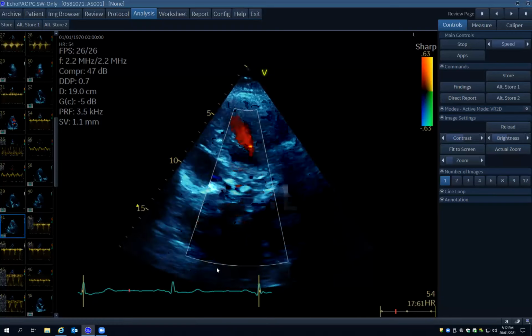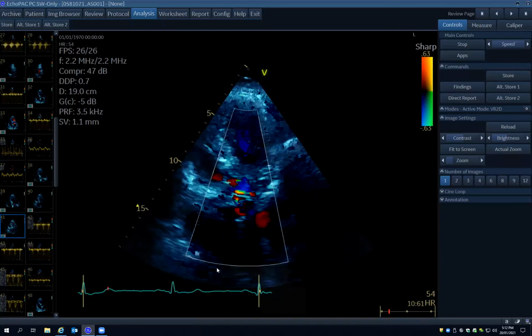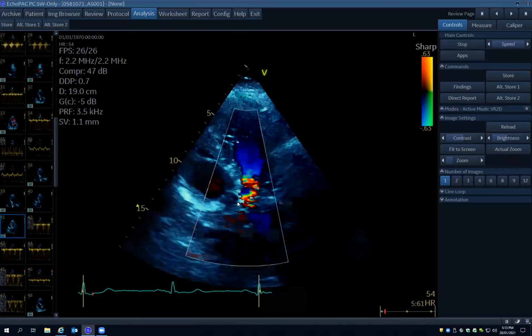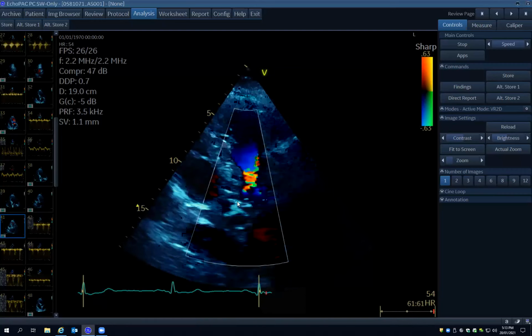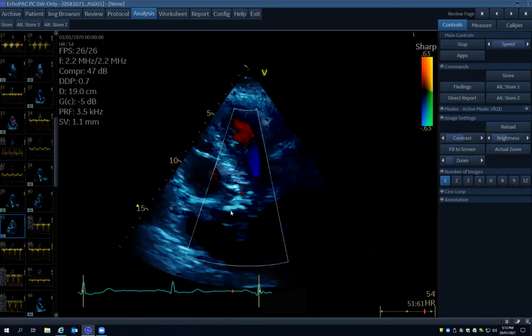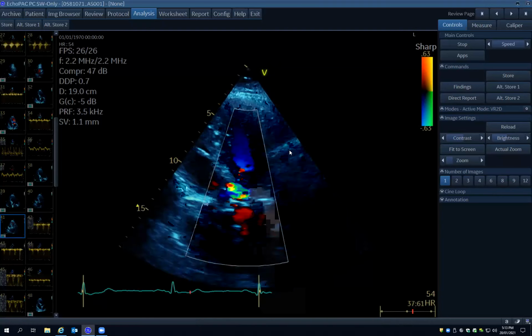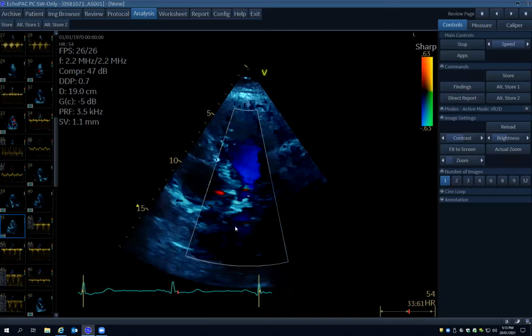So the 3-chamber view, the suprasternal, the subcostal, but here even the right parasternal. What you want to see is subcostal as well. You can create a subcostal long axis view, particularly in smokers whose diaphragms are low. But here, I would try to play with this 5-chamber view and sometimes move up or down a rib space, because you can forget about the ventricular cavity and focus on the aortic valve opening into the aorta. And I suspect that you may find a higher angle.